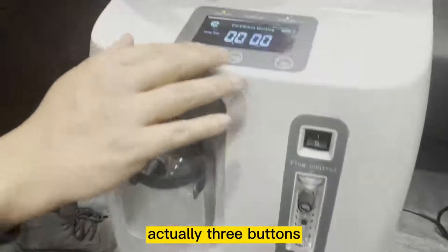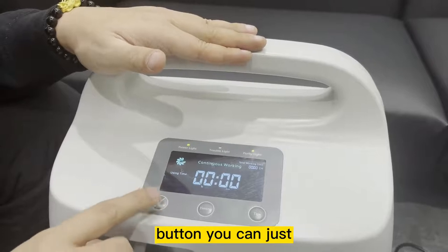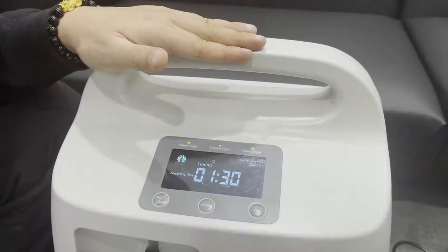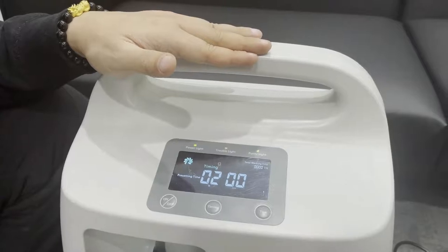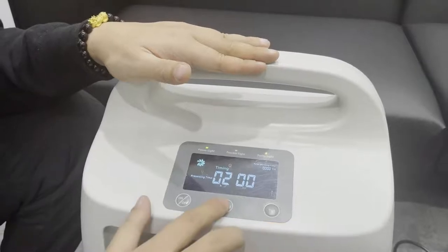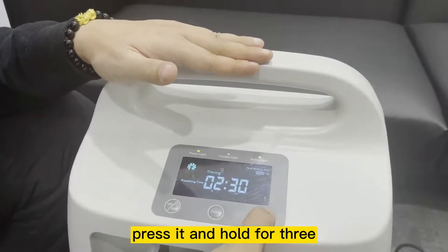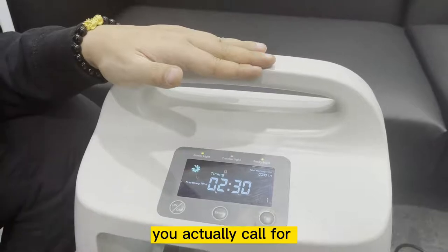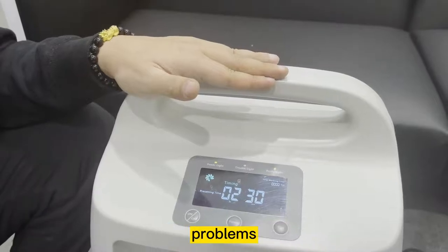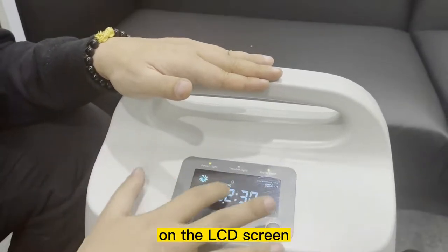There are three buttons on top of the machine, slightly below the LCD screen. The first is the on/off button — you can turn the machine on with one button. The middle one is a timing button: if you are about to go to sleep, you can adjust the timing function, for example to two hours, and the machine will automatically switch off after two hours of usage. With the T button, when you press and hold it for three seconds, you will activate the voice function. This is very useful for elderly users who have hearing problems or difficulty reading the LCD screen — they can follow the voice prompts to operate the machine.